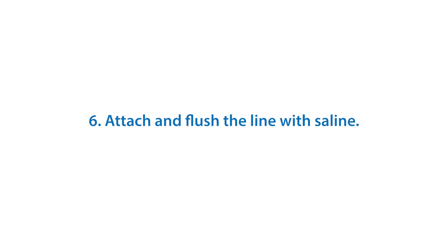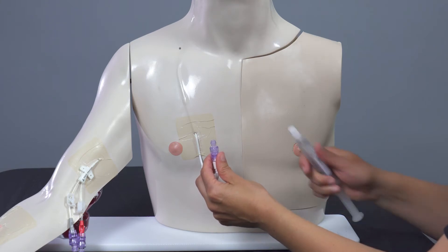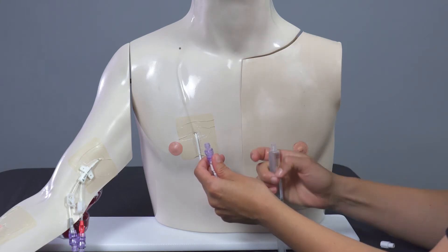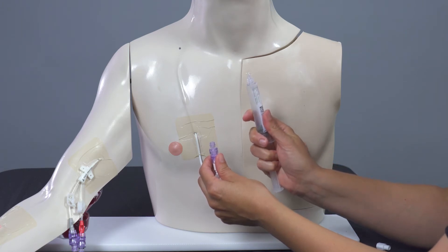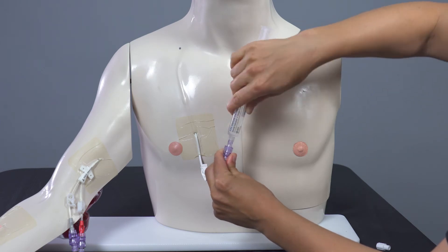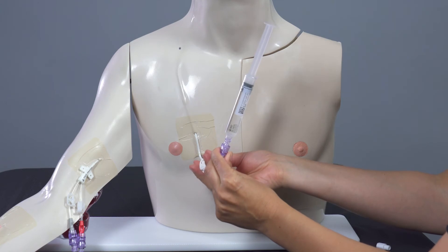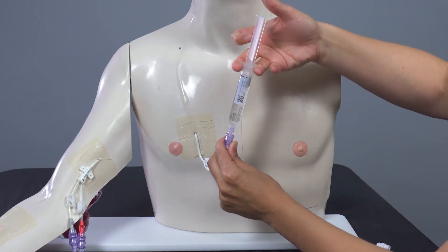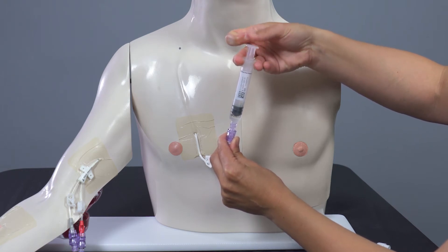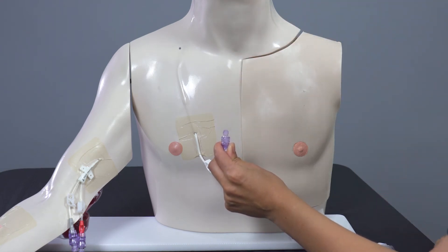Attach and flush the line with saline. Keep control of the line. Re-clean if the cap touches anything. Take the cap off of the saline syringe and push the air bubble out before attaching. Push and twist saline syringe into cap. If your child's line has a clamp, unclamp it now. Pulse flush the entire saline syringe. Holding the clear cap firmly, untwist to disconnect saline syringe and discard.